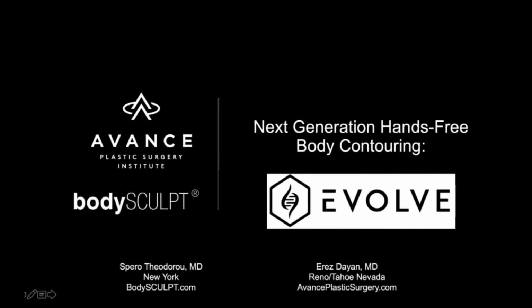Okay, great. So here's our lecture. So really what we're talking about is hands-free body contouring. Hands-free meaning, you don't have a person who's required to use the device actively during the treatment.